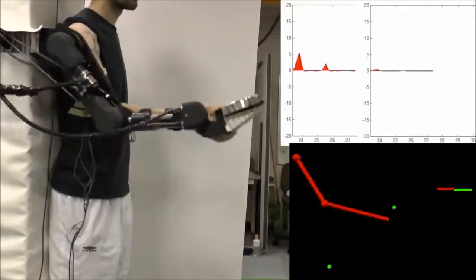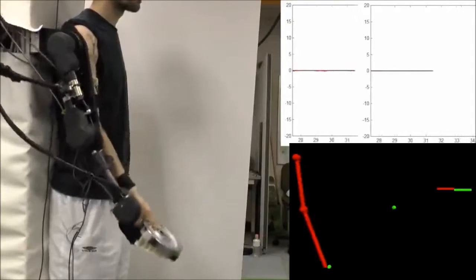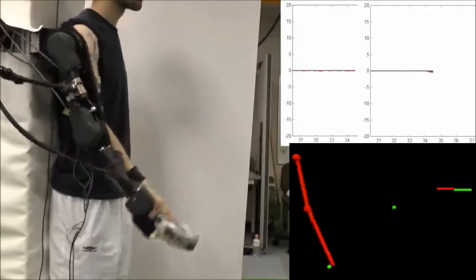The upper left graph shows the muscle activity feedback signal related to the shoulder joint, while the upper right graph shows the same for the elbow joint.